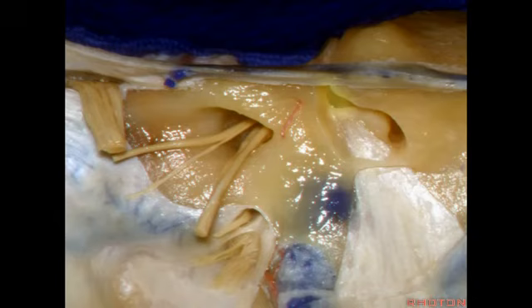And you can drill into it then, common crus, or you can get into the endolymphatic sac. Here we see the hiatus, and it sets in the dura on the back of the meatus. Someone, or a lot of you, are going to get a piece of rubber dam into the endolymphatic sac.